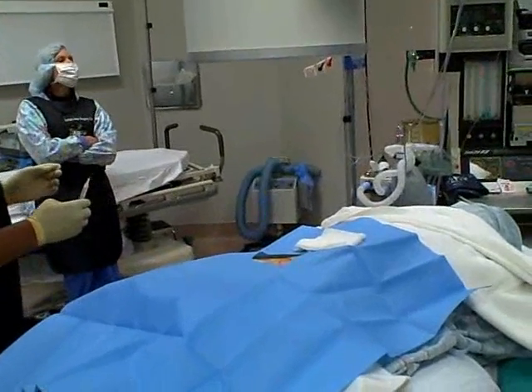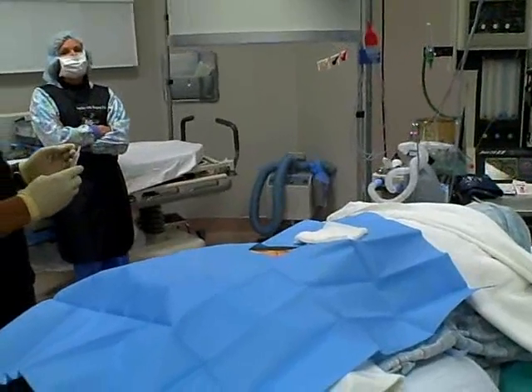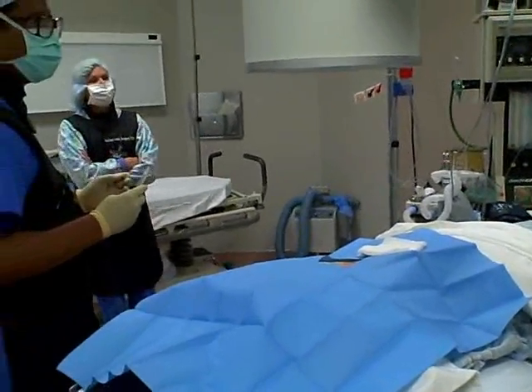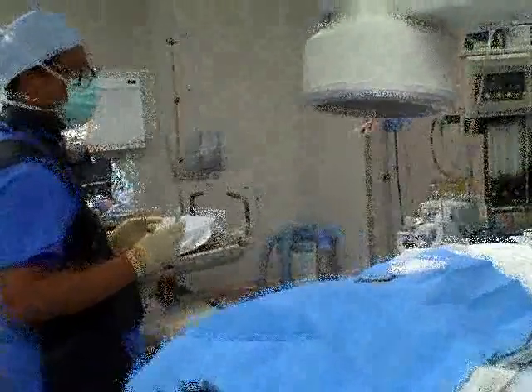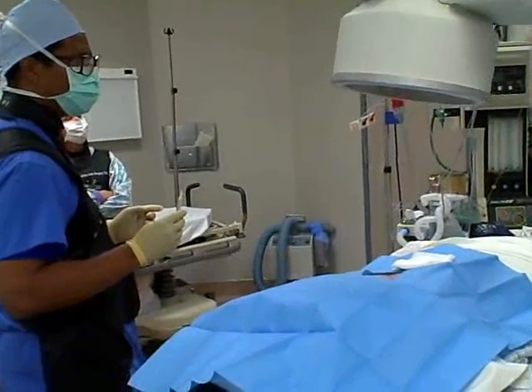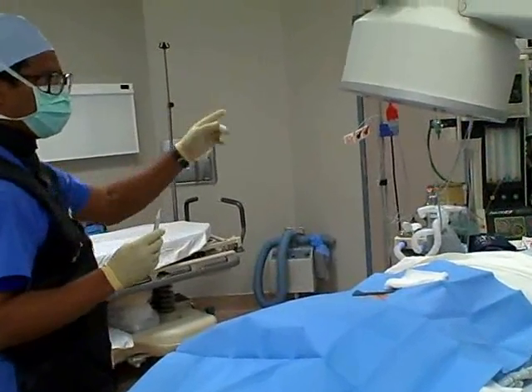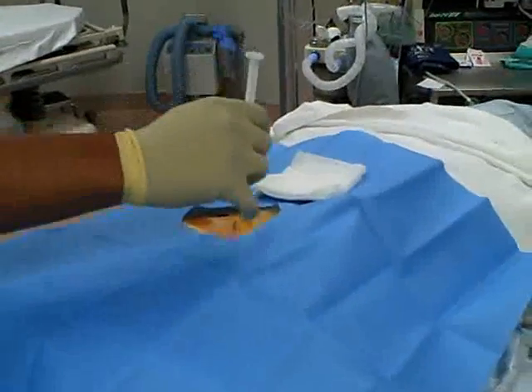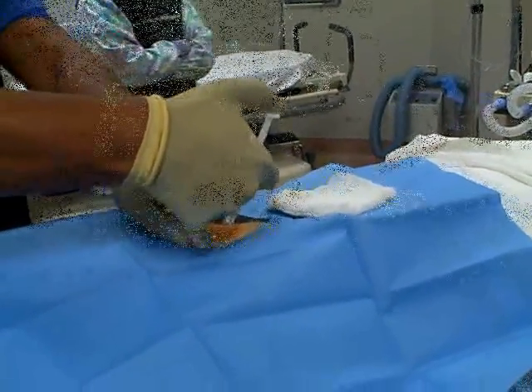After having drawn up all of the medications, we turn our attention to identifying our target for injection. We use a fluoroscopy machine or a live X-ray machine to identify that target. We've usually predetermined the target for injection based on a combination of factors, including the patient's physical examination, where they're feeling the pain, and the abnormalities that have been seen on MRI, CAT scan, or X-ray.